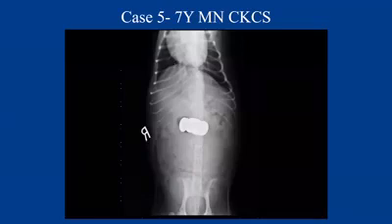So then we were like, whoa, this patient has Heinz bodies and spherocytes, and that combination should immediately make alarm bells go off in your head for zinc toxicity. Zinc is found in various metal objects.